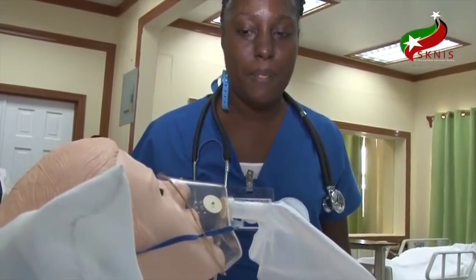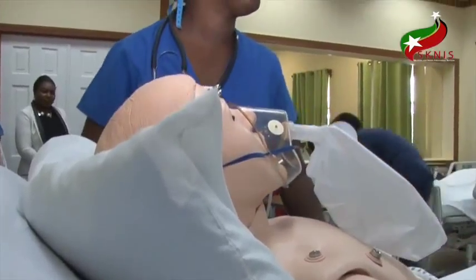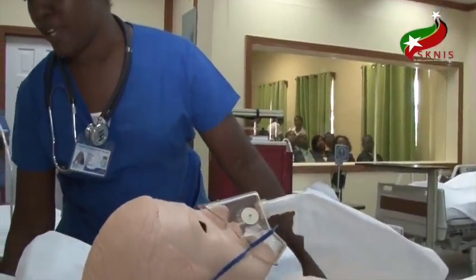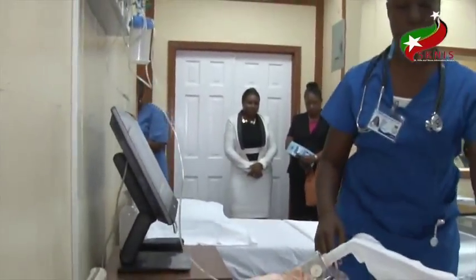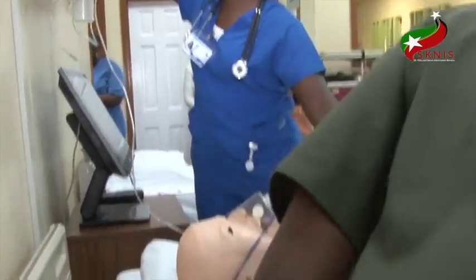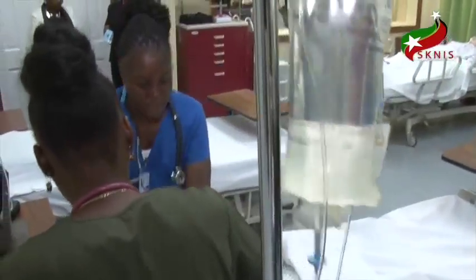Mr. Brown. Mr. Brown, code blue, can I get some help in here, please? Ms. Bedford, you call a doctor and tell the doctor my patient has gone unresponsive. There is no pulse, no BP, and no respiration. CPR is in progress.